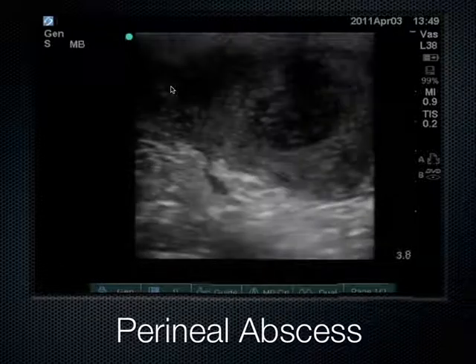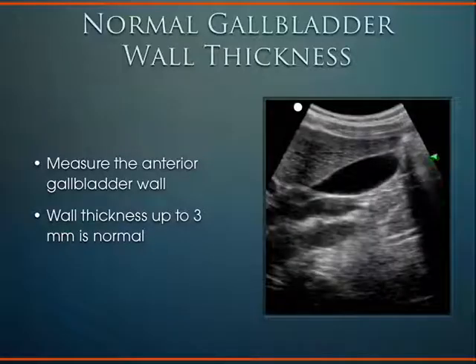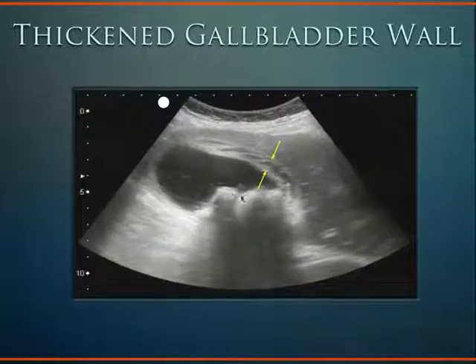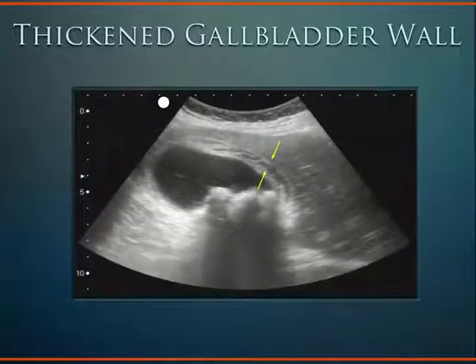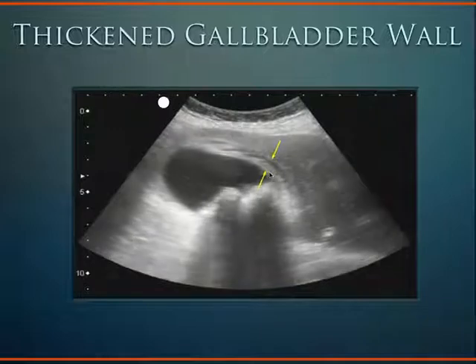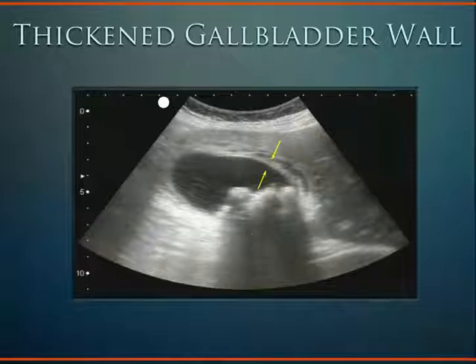The rest of the abdomen — we can see infections such as cholecystitis, or infection of the gallbladder. The gallbladder normally has a wall less than three millimeters, measured on the anterior surface. With cholecystitis, the gallbladder wall becomes quite thickened — here we can see it's well over three millimeters, very edematous. We can see gallstones causing shadowing. This is a case of acute cholecystitis.